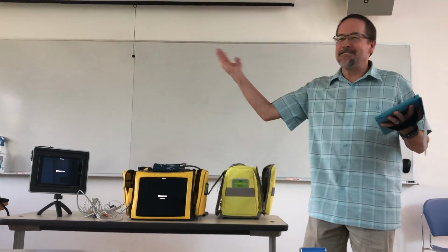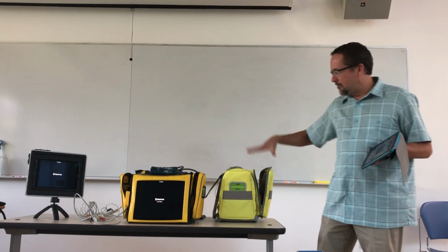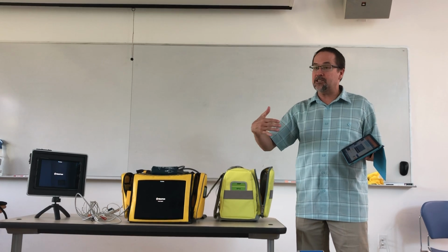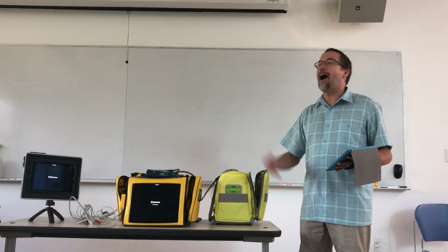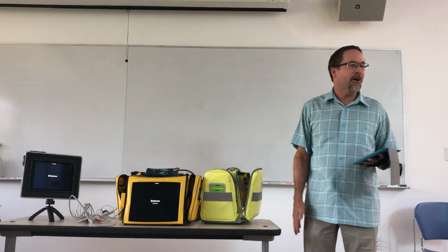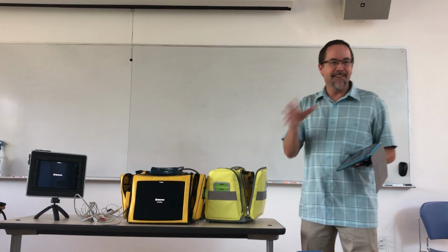Yeah, you guys have all played with them. They're just really limited tools. And if this becomes the standard where you can duplicate it, I love it for testing. When we do testing using this, the student comes in, you say, what monitor are you familiar with? Cool, you get to test on a monitor you know. I'm not here to test you on a monitor you've never played with. I'm here to see if you know how to run a call. That's so much more fair and legitimate than tripping people up with equipment they're not familiar with.